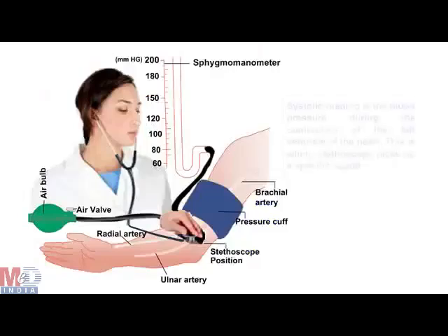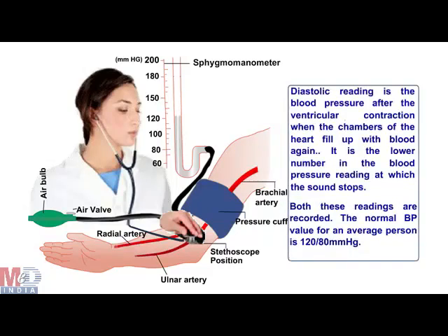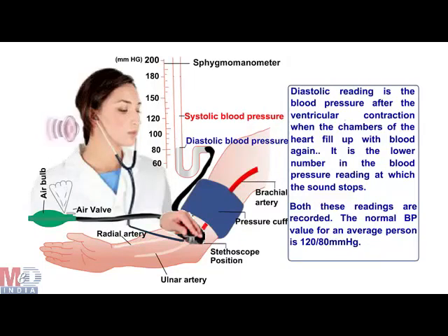systolic and diastolic pressure. In order to test the validity of our device, we simply compare the readings taken using our device with the readings taken using the auscultatory method. We decided to use this method of testing as our control because the auscultatory method is the most common means of checking for high blood pressure. Based on this comparison, we determined that our device provided a reading that was adequate enough to determine if a patient has high blood pressure.